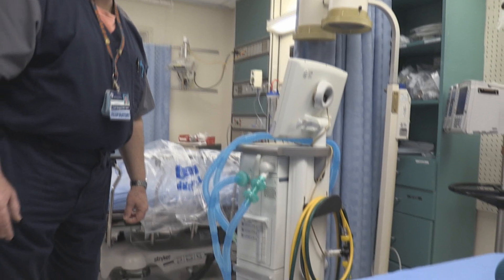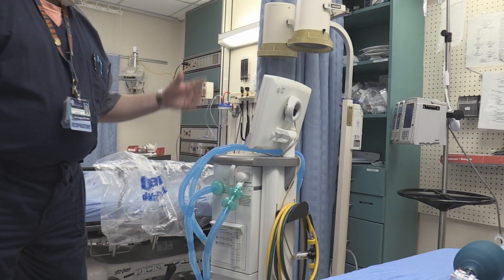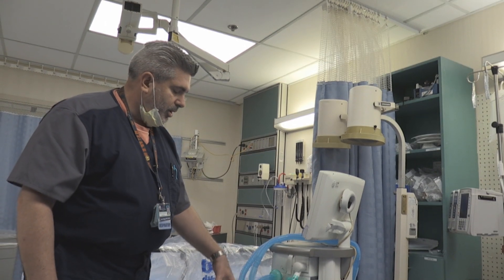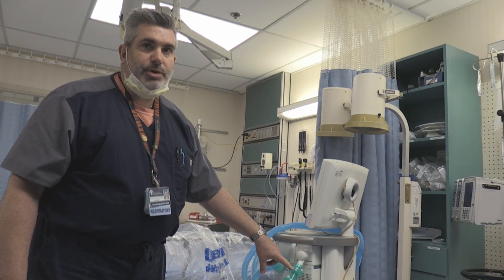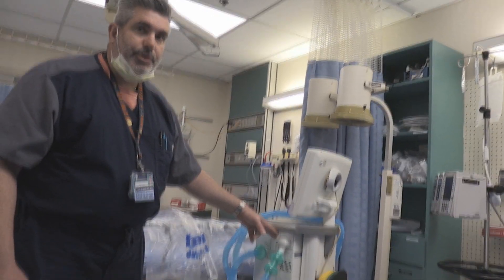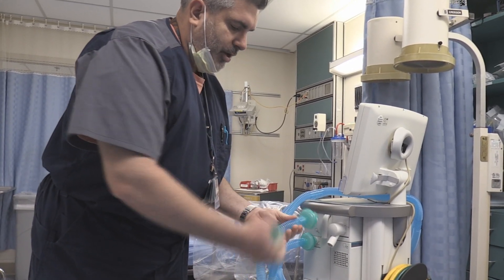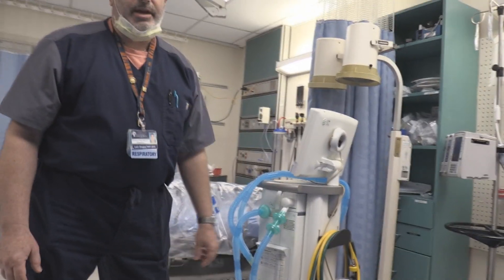One reason we like to double filter is these patients may have medications aerosolized in the ventilator circuit. Plus normally in an ICU setting you have a heater and humidifier on the inspiratory side, so you've got water and humidity — over time condensation will build up in the filters. This gives you greater protection for your exhalation valve. What we'll do is rotate: throw the one closest to the patient away, move the other one forward, replace it with a brand new one on the back — and we change these out about every two to three hours.